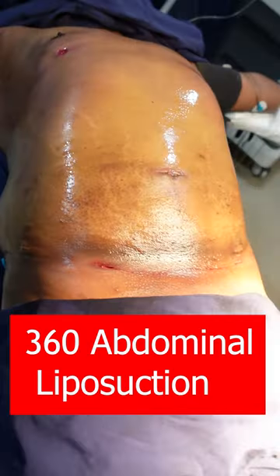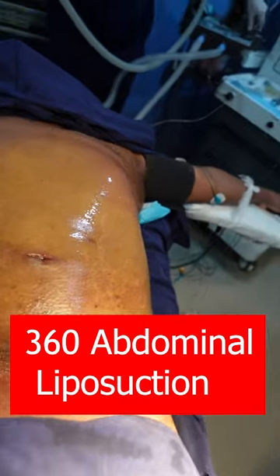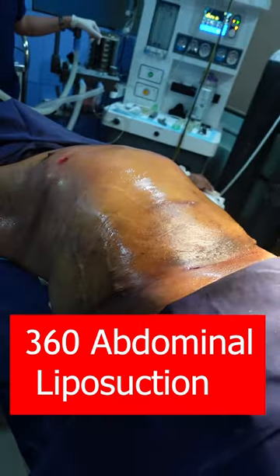This was a bit removed from the side. So, we have more than 11.5L of fat removed from this side. Here is some difference for the result.